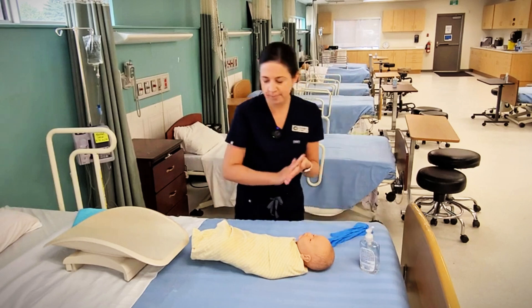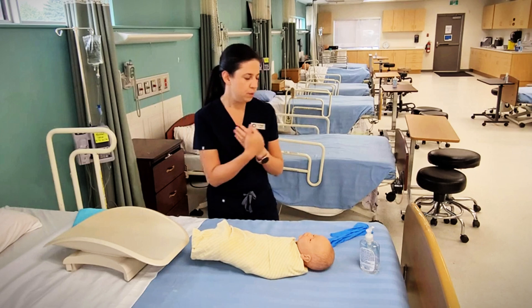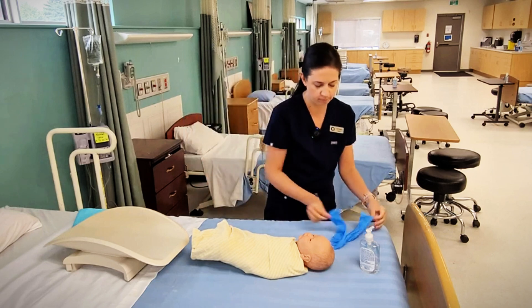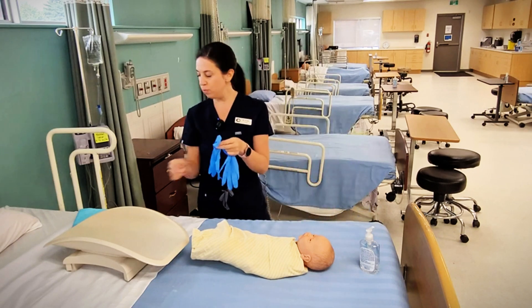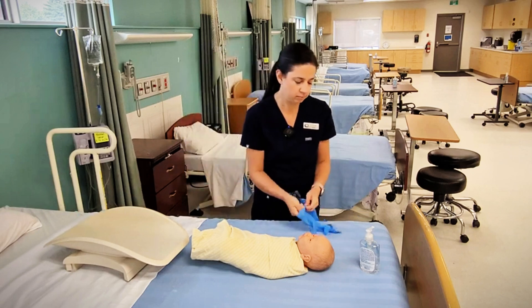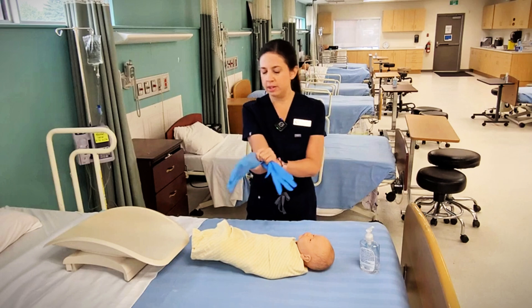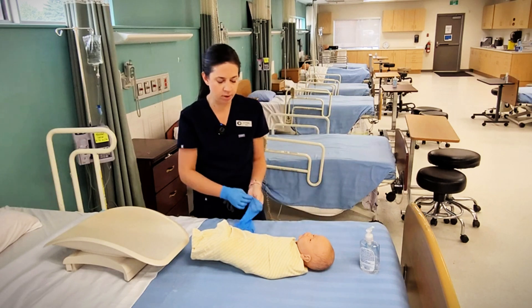So we're going to perform hand hygiene. Since we're handling a baby, we should put on our gloves. I need to bring my scale into the room and I'll also need a blue pad as well. Baby should be weighed completely naked, so I can ask the parents to undress the baby while I'm getting ready.